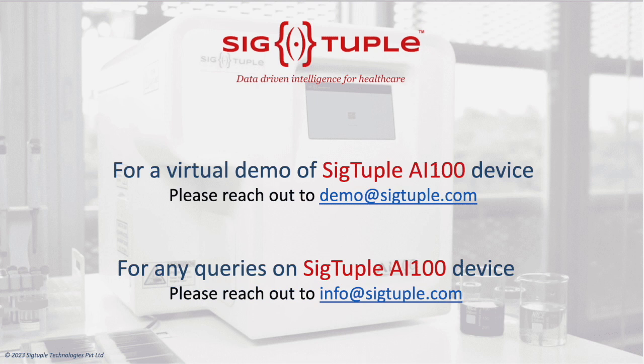Right, very true. That is going to improve the quality of the general working in your lab. Yes, exactly. Even the technicians will prepare it better. So we don't do a manual smear, right? In this case, it's better if we do it machine-based, because with manual smears it's very difficult to get good standardization, since it depends on the technician, and a lot of things are there. Sometimes on-site manual smears are not made; we make an indirect smear when the sample comes to the laboratory. Right. But in our practice, madam, wherever we have put our installations, I don't think we've really found too many issues with manual smearing.